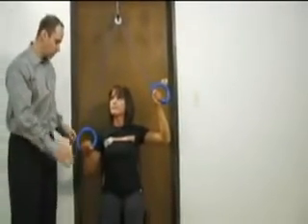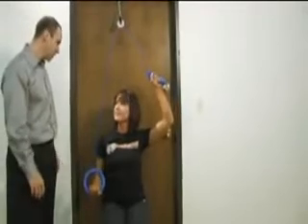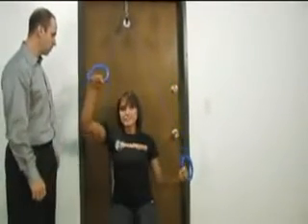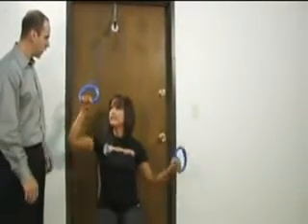So Jenny, demonstrate just a regular flexion exercise for me. And then come all the way down. Does that feel pretty easy? Yeah, it's pretty easy. Okay. And how does the stretch feel at the top of it? Let's try one more time here. Not too much. So it's kind of low grade? Yep, low grade, kind of comfortable.